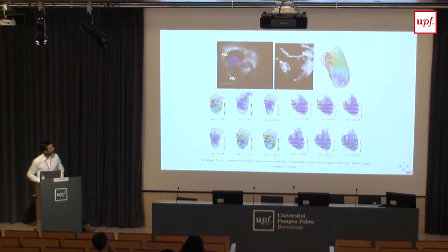So what we showed, this is as the cardiac cycle goes. So we saw that the vortex was forming more or less in a normal way in the patients with this shape of ventricle. But in patients where the ventricle was elongated, the vortex only formed on one side. And actually, this is highly inefficient. And these patients both actually will need some surgery. But then using these techniques can help clinicians decide what surgery would be best to correct for these issues.